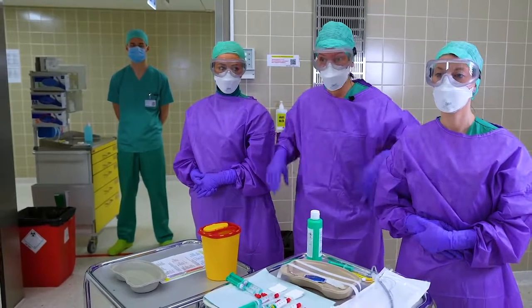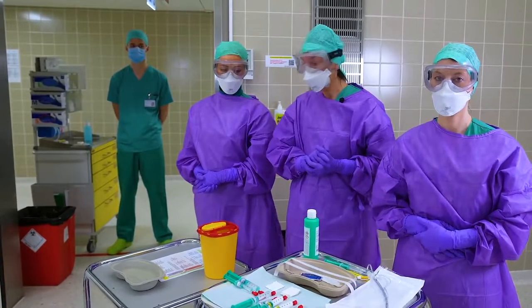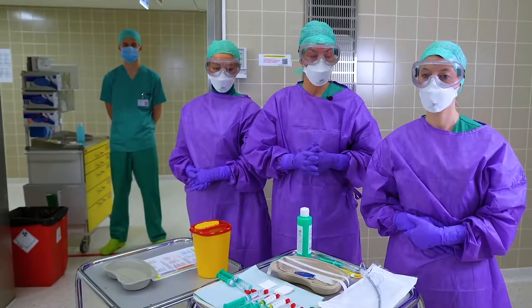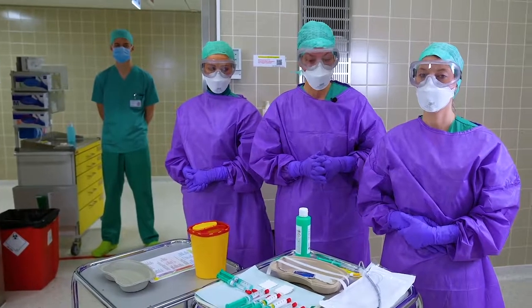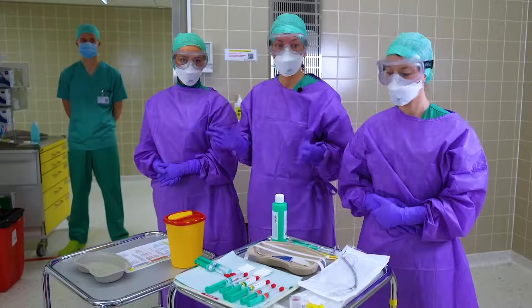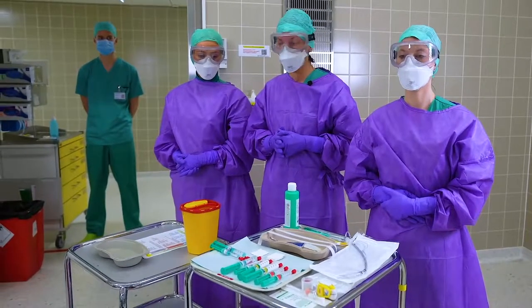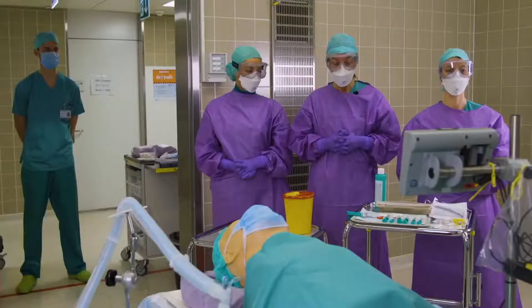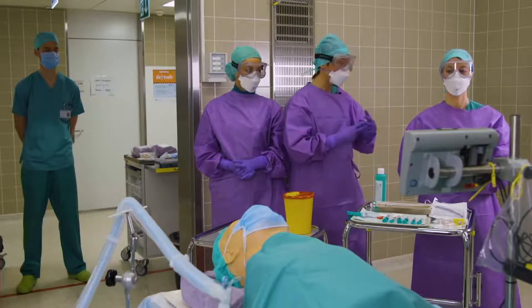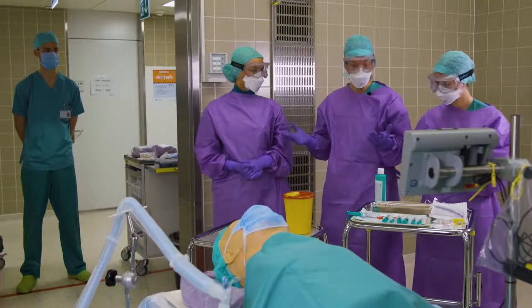Our concept is divided in three phases: the planning phase, intubation and extubation, as well as postoperative care. All these phases are equally important. As you can see, we are all donned in protective gear, which is according to your local SOPs.